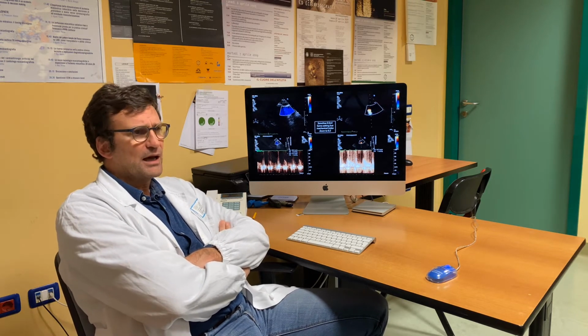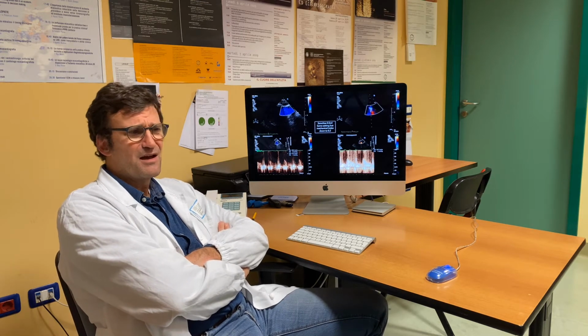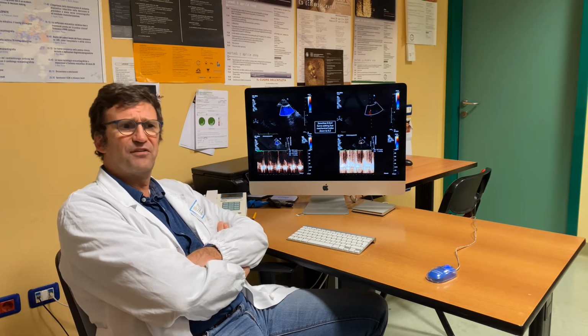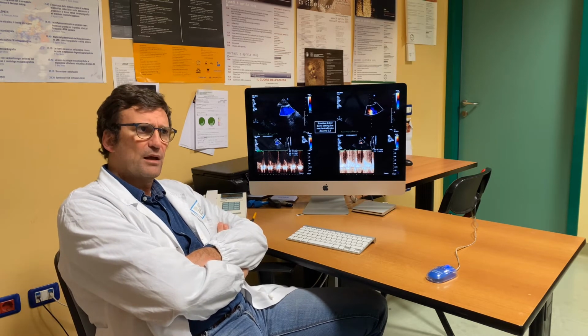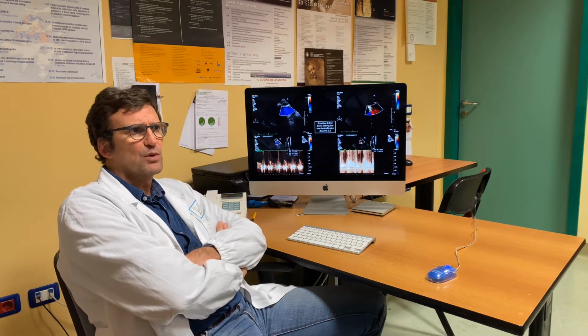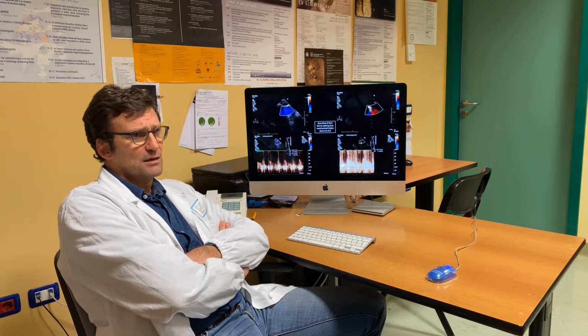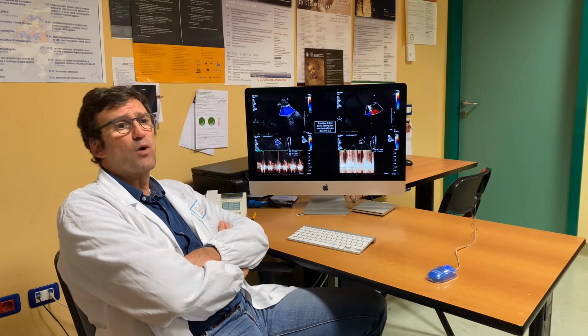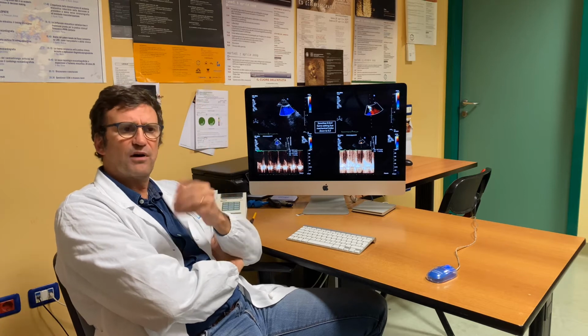In standard patients, 2.0 is okay. I would use maybe 2.5 in young athletes, because we saw athletes with coronary artery disease in the LAD who still had a CFR of 2.1, because they started very high, 3.5 and so on.